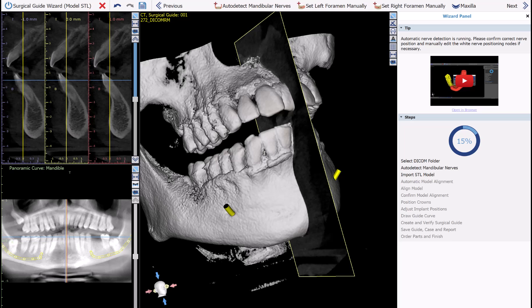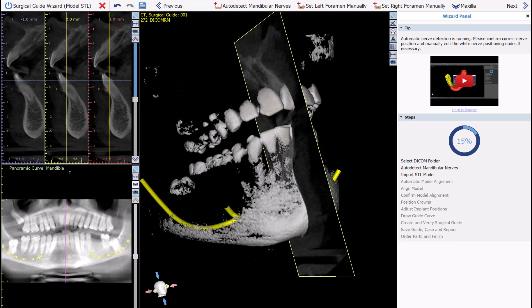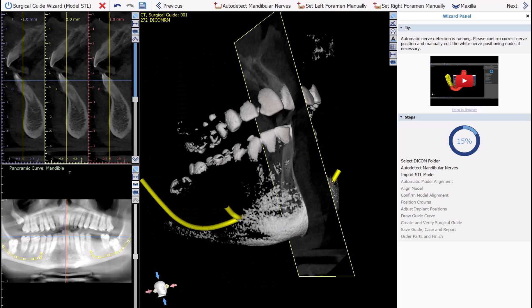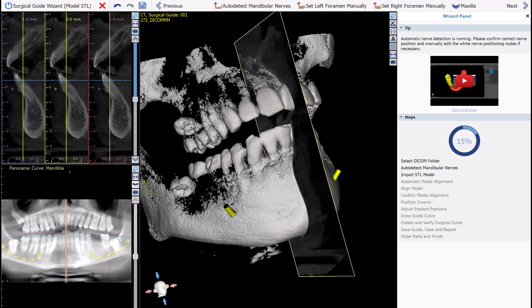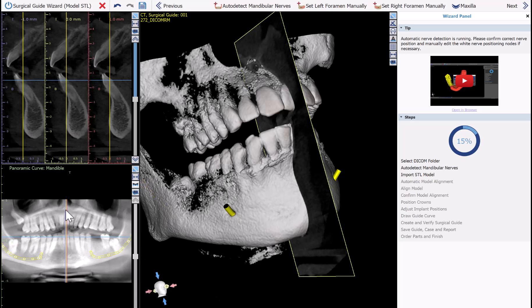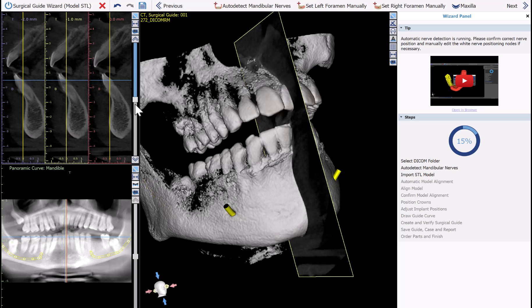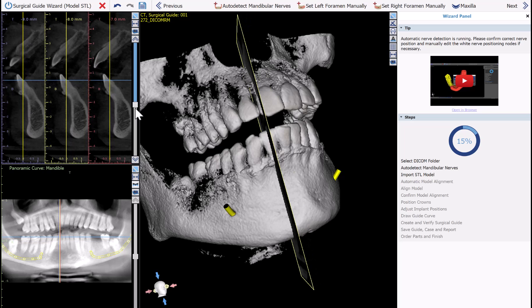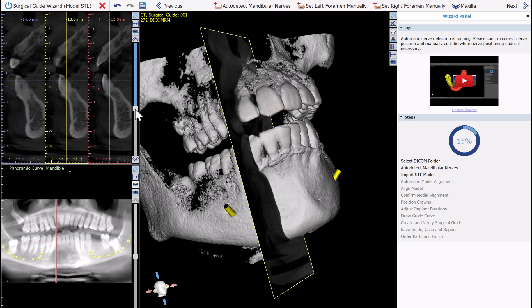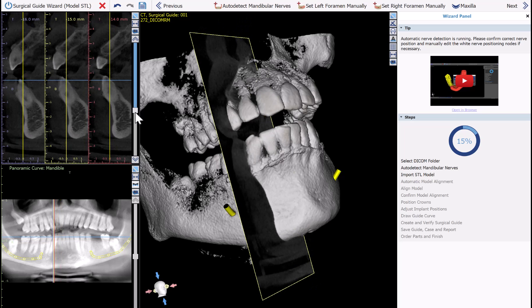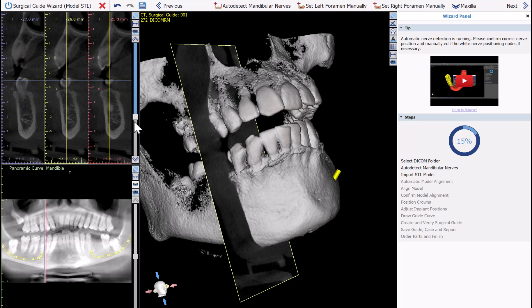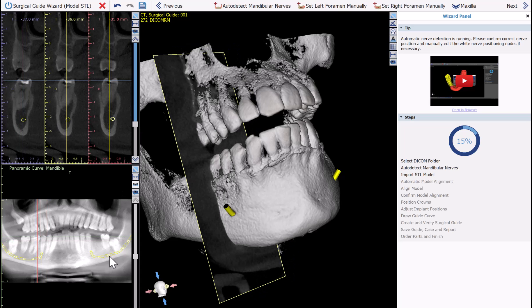If we lower the density threshold, we can see the nerves, and we can see the nerves as well in the relevant 2D views.